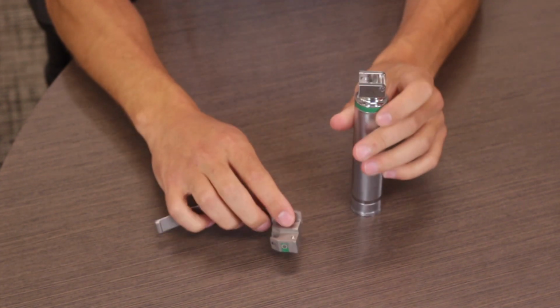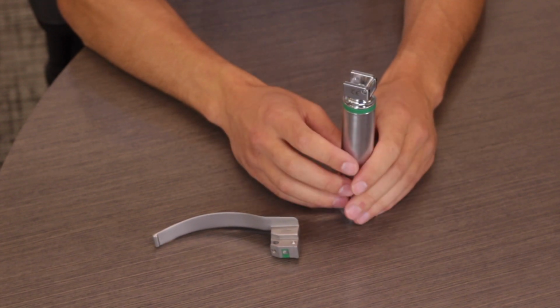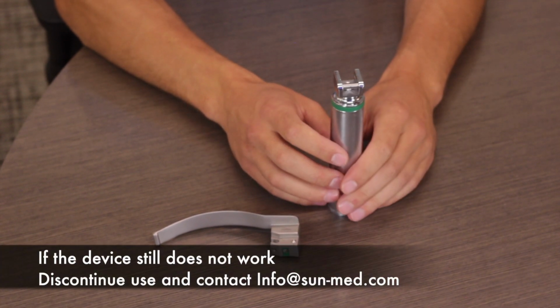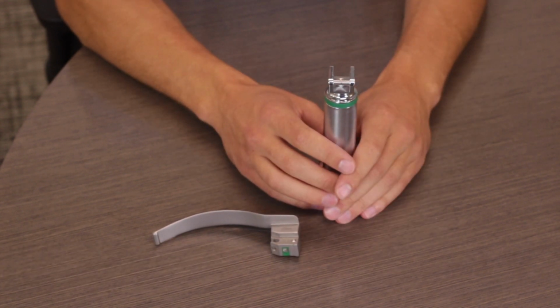If for any reason the lamp is not functioning, please double check your batteries and double check your lamp cartridge. If the device is still not functioning properly, please discontinue the use of the device and call your SunMed rep.